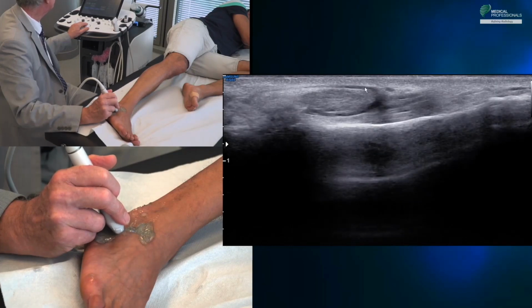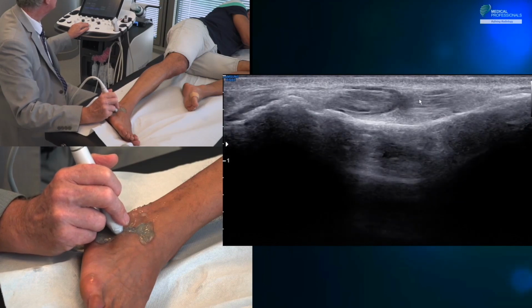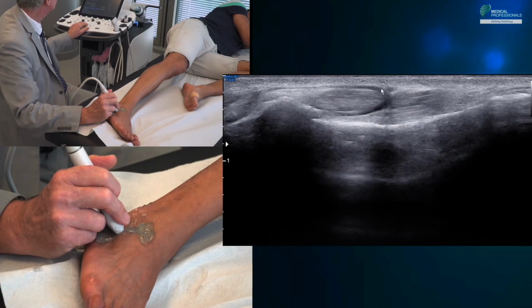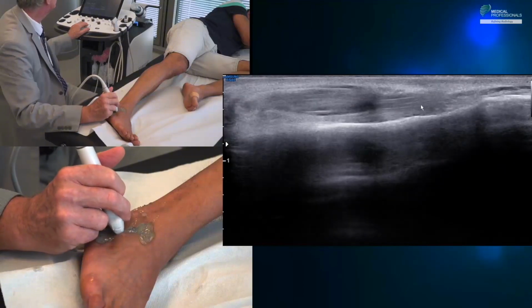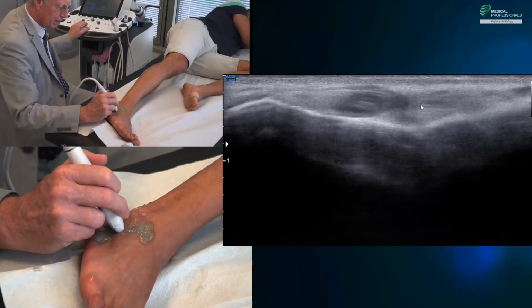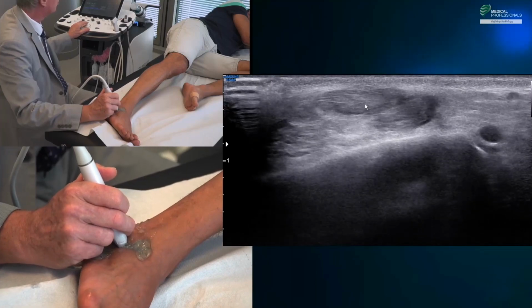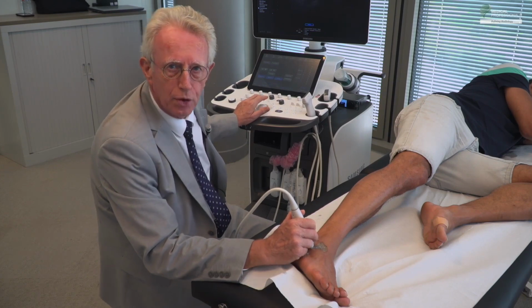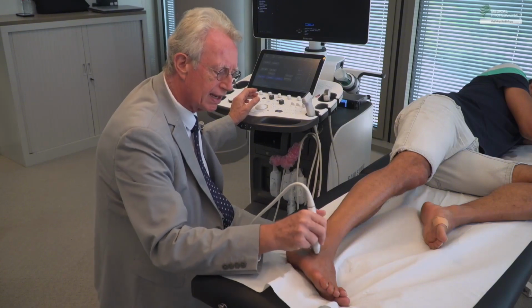This lower peroneal retinaculum is the site of a very specific pathology, which is its thickening that grips the peroneal tendons as if clamped in a vise. It is a stenosing pathology similar to that of the wrist with De Quervain's tendinopathy. At this location, we can obviously see all the tendon pathologies. We can see tenosynovitis, fissures, as well as ruptures. We can also see calcifications and even see cysts.